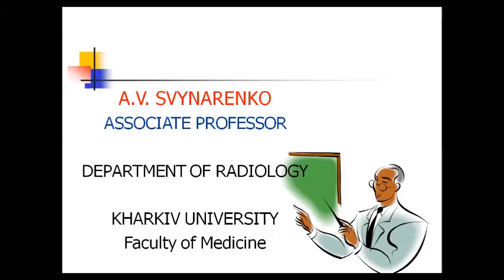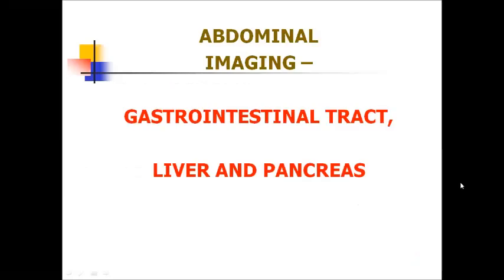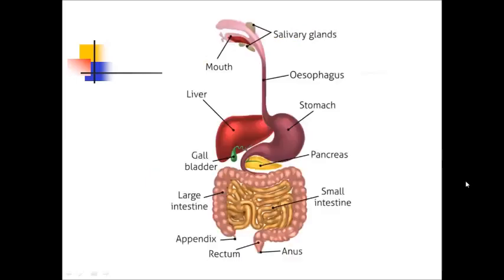Okay, hello everybody. Let me continue lectures on medical radiology and present you our next topic. We are going down from chest cavity into abdomen, and now we'll observe different diagnostic approaches to anatomy and pathology of gastrointestinal tract, liver and pancreas.